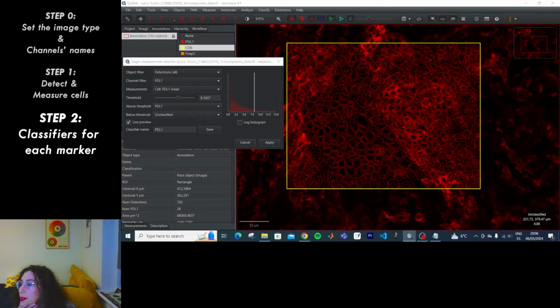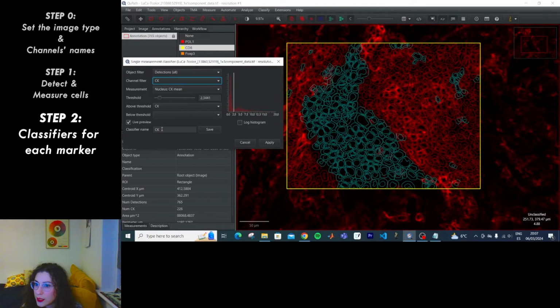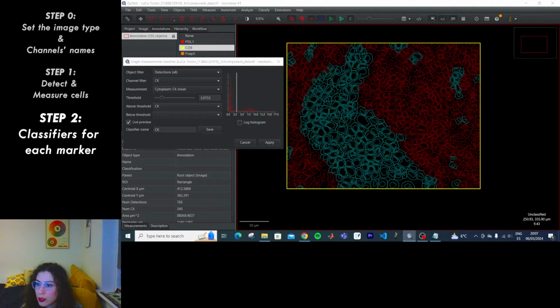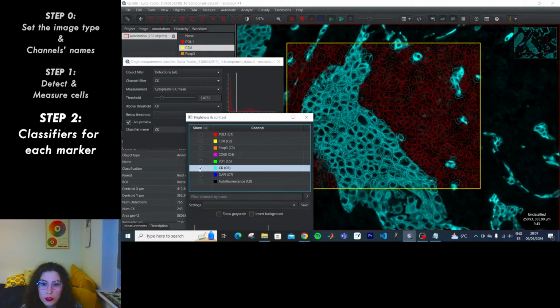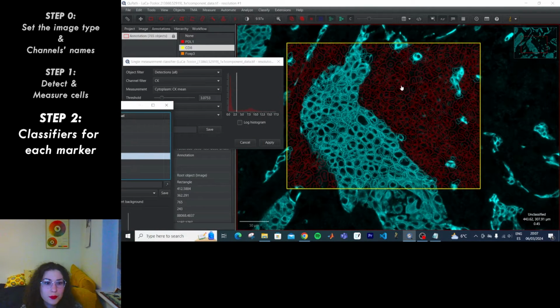I don't know if I'm supposed to be seeing anything. If I am, I guess someone will tell me at some point. Probably Pete. What if I try a different thing, like CK, cytoplasmic CK mean? Oh, now it has changed. Okay, wait. Let's show CK. Now it makes sense.